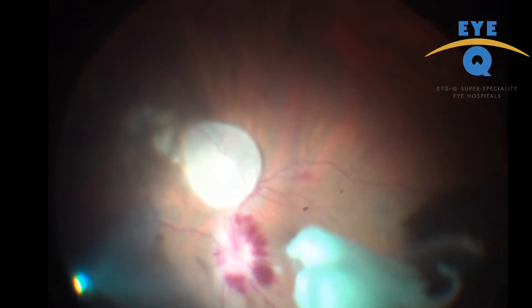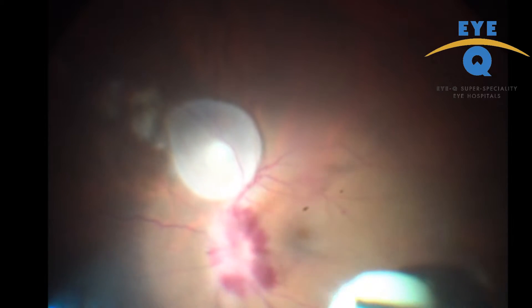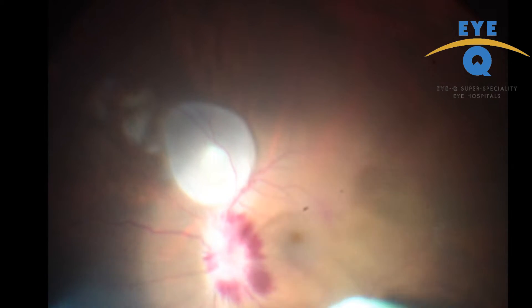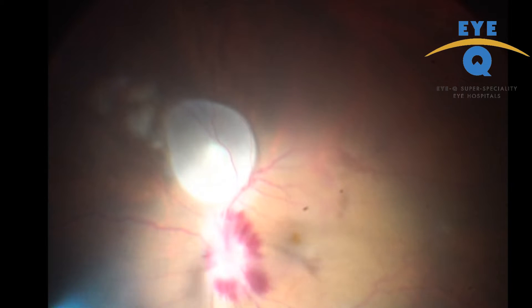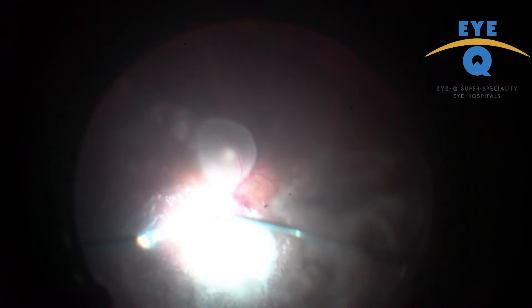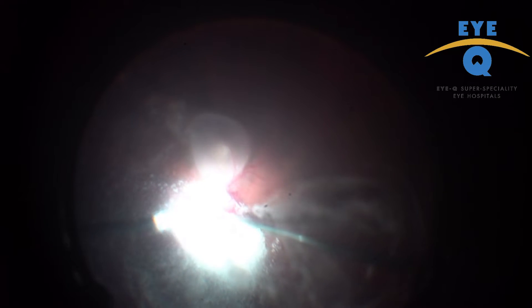A 25-gauge pars plana vitrectomy was planned to remove this live cyst. PVD induction was done cautiously because of the inflammation at the optic nerve head.